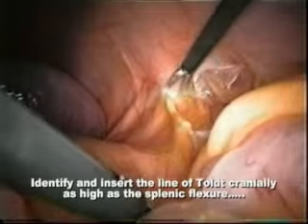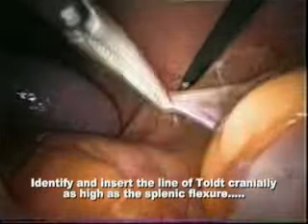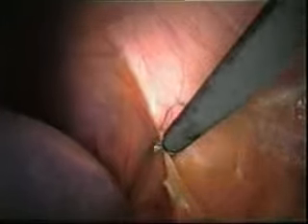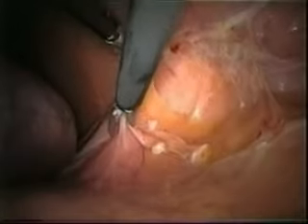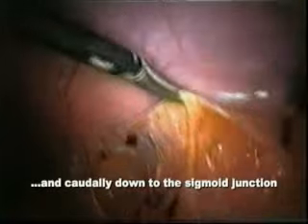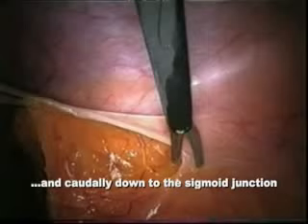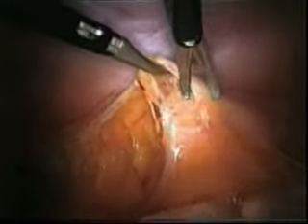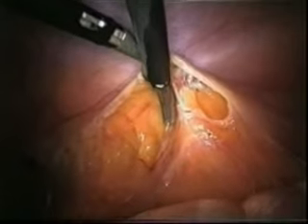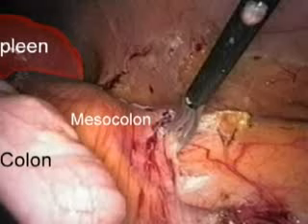We identify and incise the line of Toldt cranially as high as the splenic flexure and caudally as far low as the sigmoid junction. The medialization of the left colonic flexure follows. The colon is mobilized medially to expose the upper pole of the kidney and Gerota's fascia.